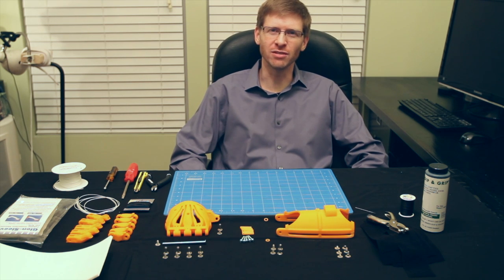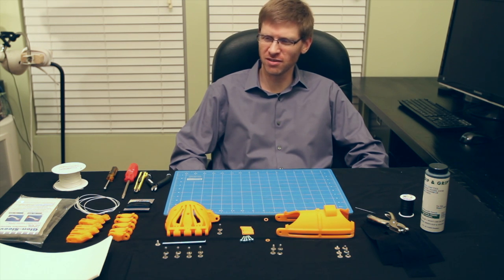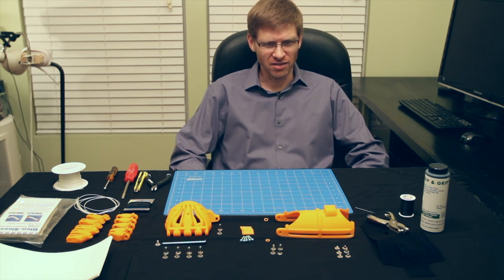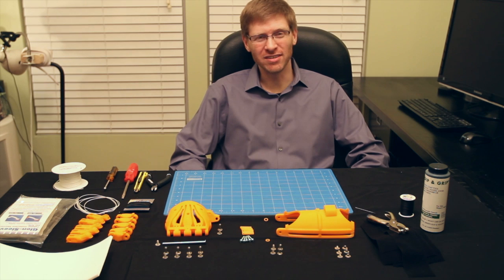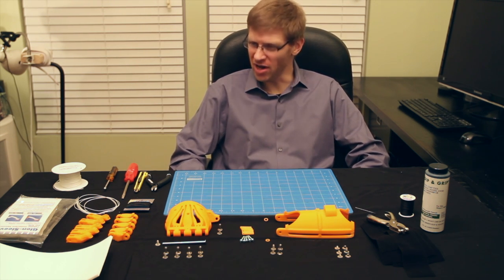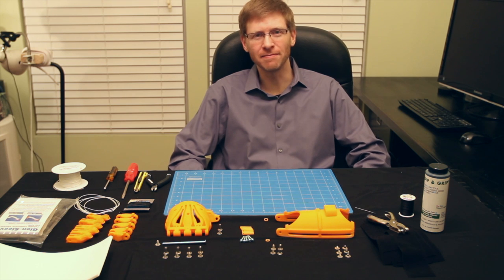Hi everybody, everyone. Jeremy Simon here with 3D Universe. I thought we'd do a fun little experiment today. I was getting ready to assemble a prosthetic here. It's called the Cyborg Beast. And this is actually going to be my first time through a full assembly. I have no background in this — just a guy with a 3D printer. But the instructions are good, the models are obviously very good, and so I'm going to show here just how doable this is by anyone out there who would like to do this.